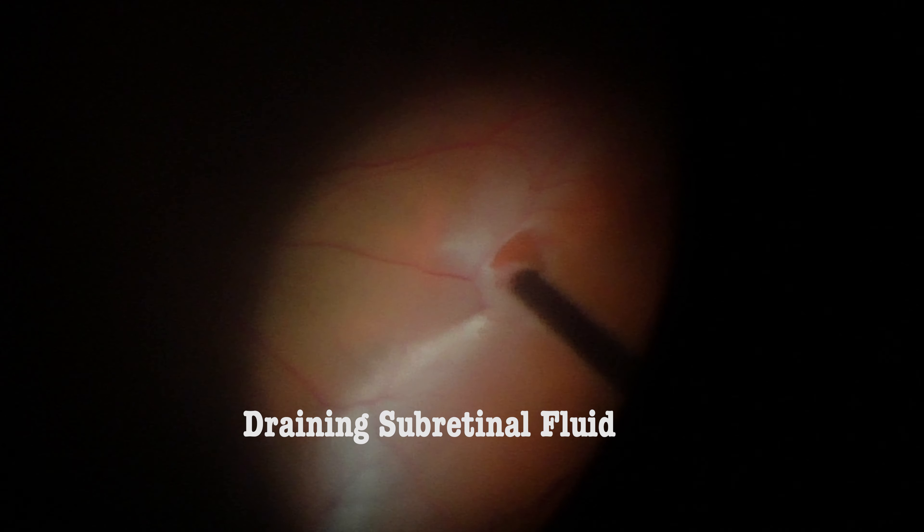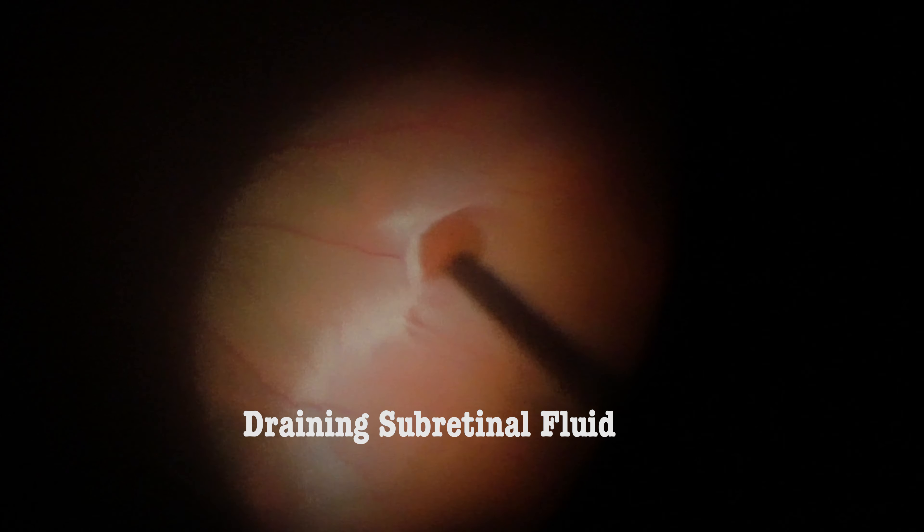Vitreous attachments should be removed thoroughly. I turn the cutter now facing the retina. See that I'm draining sub-retinal fluid through the hole.